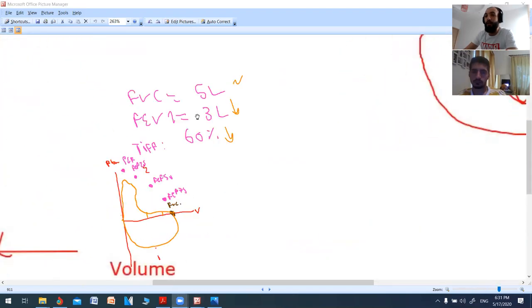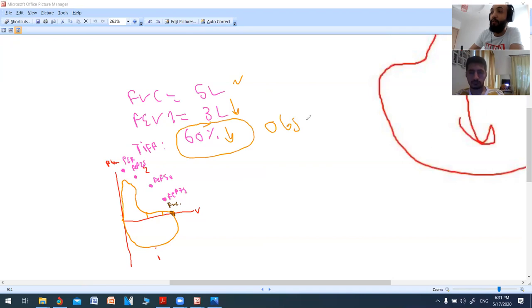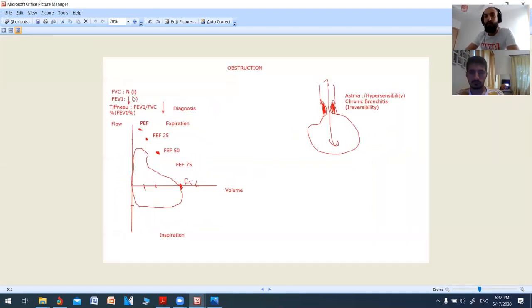I forgot to ask you, which of those can give me a diagnosis of obstruction? So I will say, he has obstruction. Which do you think? FVC, FEV1, Tiffeneau index. The Tiffeneau index, yes. When you see the Tiffeneau index low, under 70, you say diagnosis of obstruction. Is it clear? All right. After you make the diagnosis, you look at the FEV1 to see how narrow the obstruction is. So FEV1 will determine if you have a mild, medium, or severe obstruction.